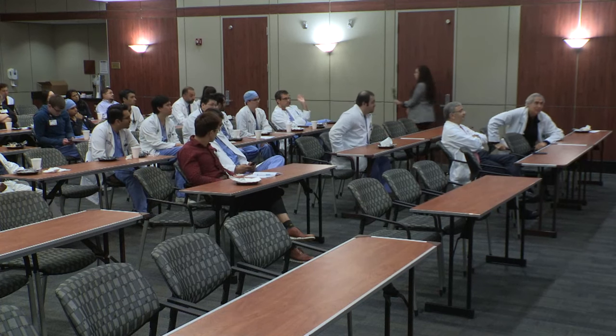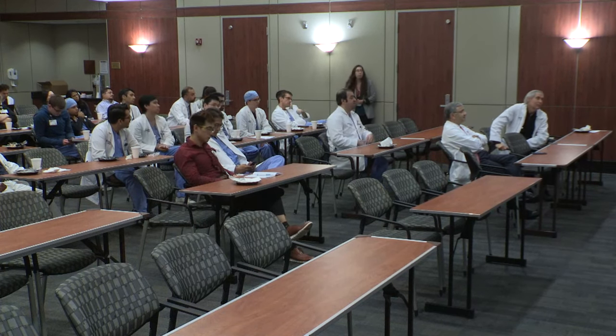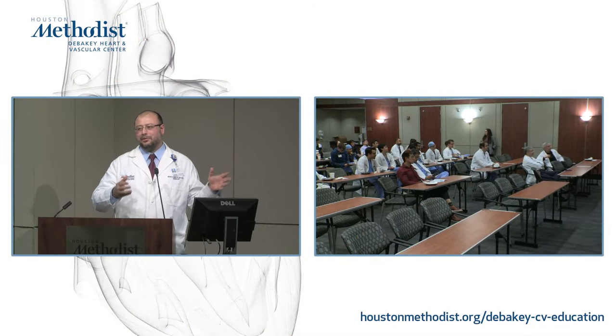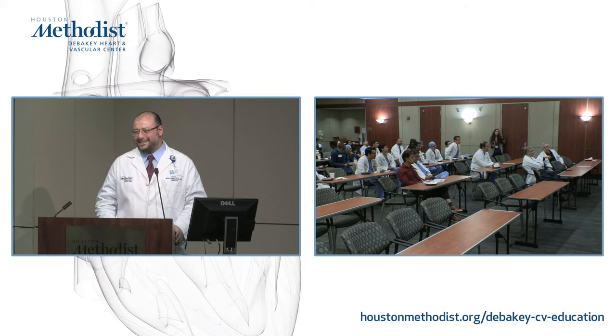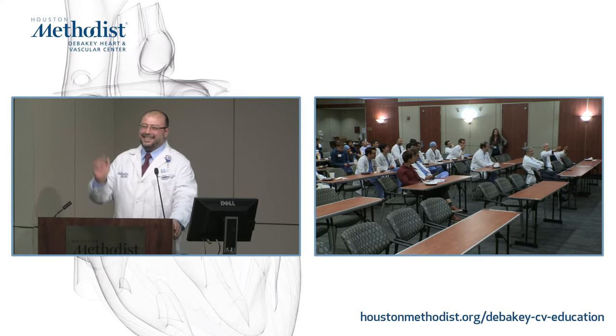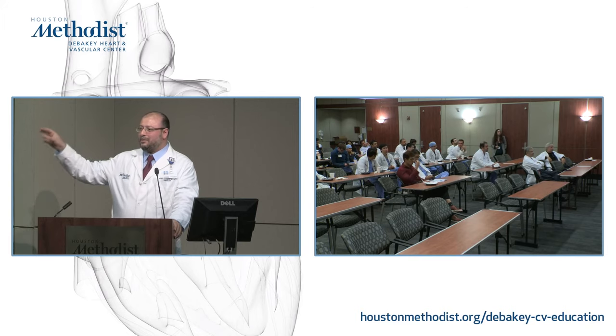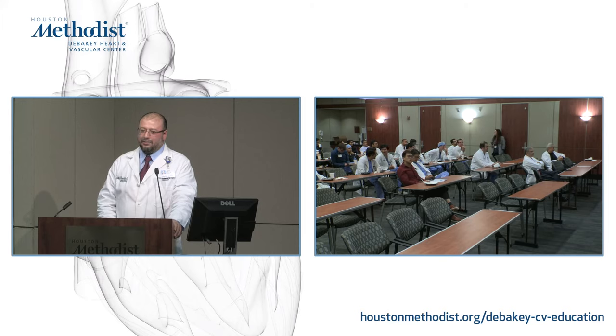So the readers, we're not reading them locally. They're going to be blinded reads. So they'll bring a computer, and he's going to go over 500 studies. Or not Dr. Mamarian. So they are blinded reads, and there's a core lab for SPECT, a core lab for PET, and a core lab for angiography interpretation.